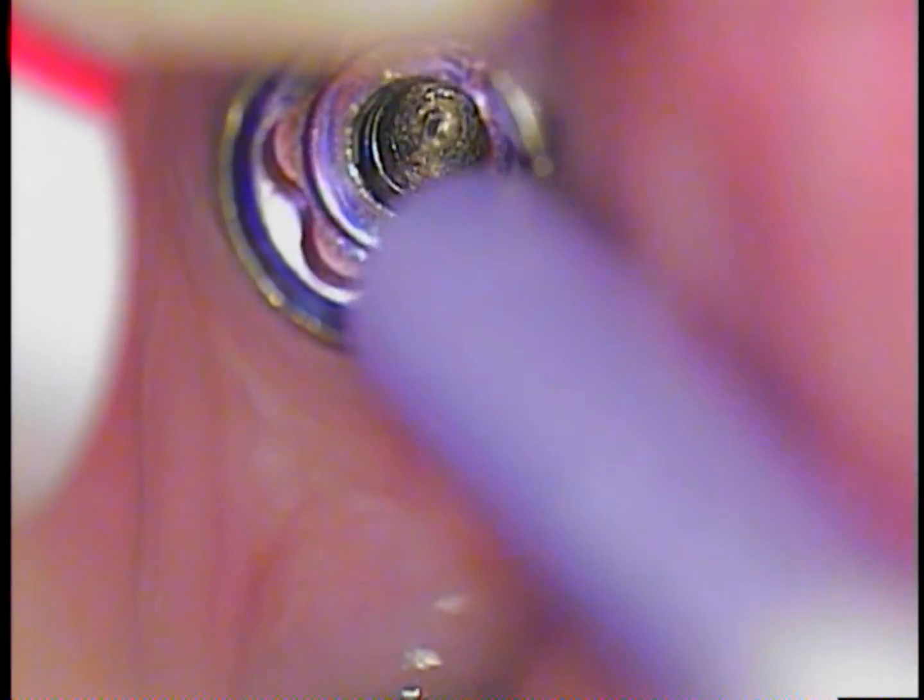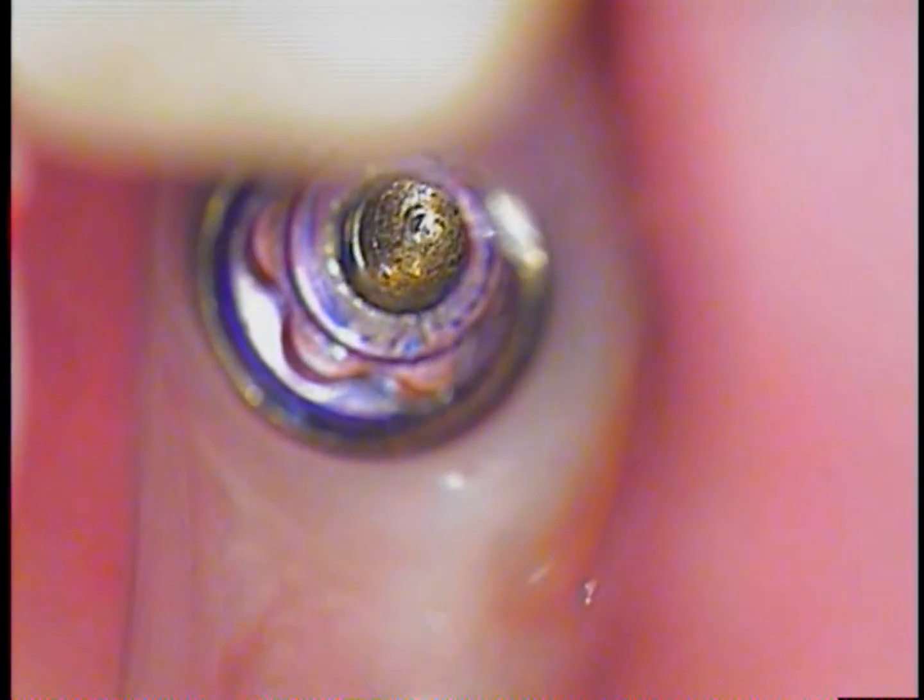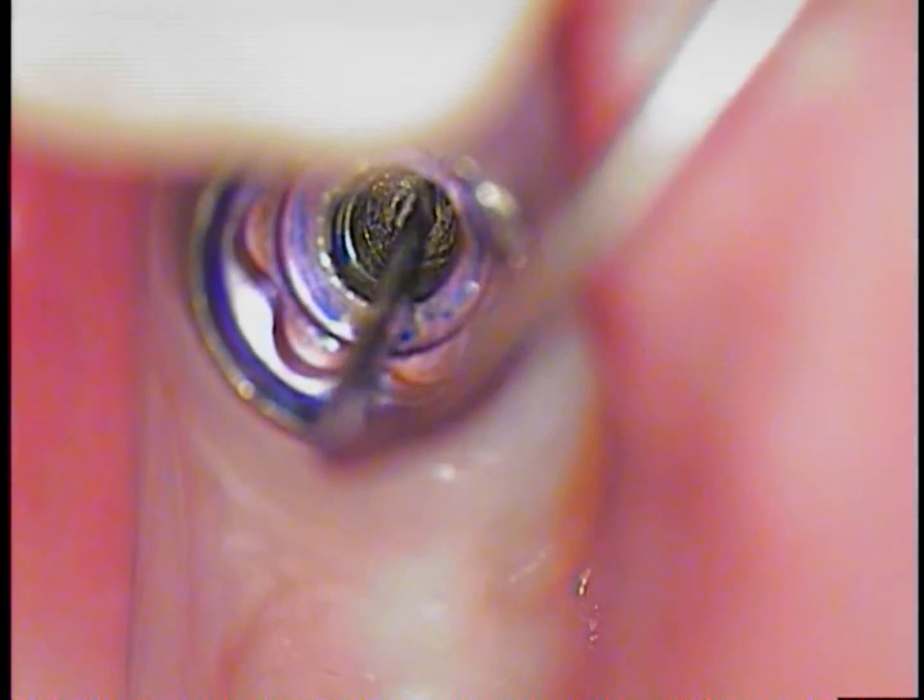So I'm removing some of the metal right now, slowly. The patient absolutely feels nothing — there's no generation of heat if you do it slowly and don't be in a hurry. You can feel it grab in there and remove and prep metal. But you've also got to remember to remove the burr and put a fresh one in — that's what I'm doing now. I'm testing now to see if there's been any movement. Sometimes it'll actually just come loose just from all the contact and vibration of the burr.